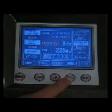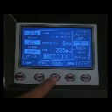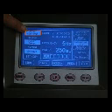Press the button Freq to adjust the frequency. Frequency means the flashes per second; it is adjustable from 1 to 6. Press the button to adjust the power. Power means the output energy of every flash; it is adjustable from 0 to 1000 millijoules.